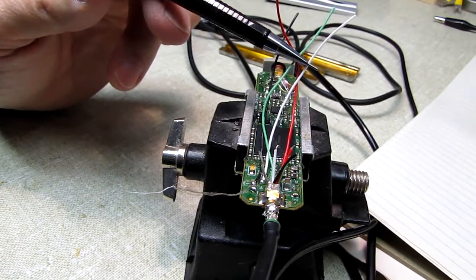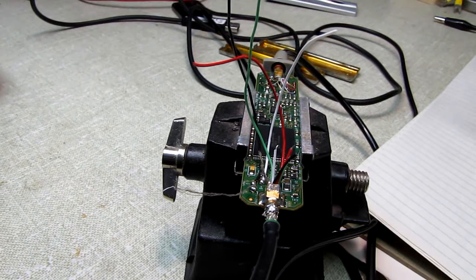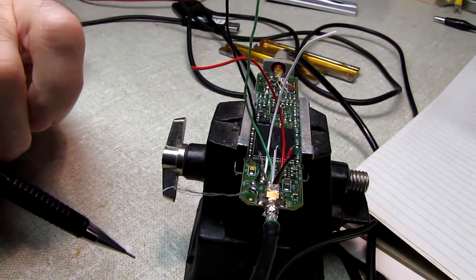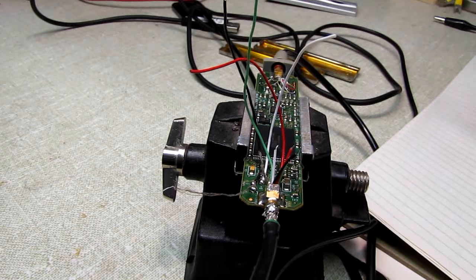And I took off about 2 inches of the cable just to make sure I got past whatever break was in there. We verified we have continuity from the USB connector up through the wires here. We've wiggled and bent around the USB connector, and hopefully when I put this thing back together it'll work. Now I do not have the proprietary software to herd all the magic pixies into organized groups and put a display on the screen. I doubt if I plug this in it will be recognized as a camera, but we'll give it a shot at any rate, see what happens. It's a USB connector. What can possibly go wrong by just plugging it in and seeing what happens?